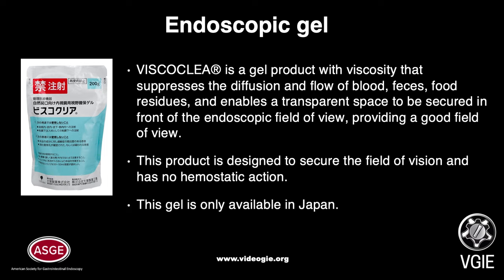Viscoclea is a gel product with viscosity that suppresses the diffusion and flow of blood, feces, and food residues, enabling a transparent space to be secured in front of the endoscopic field of view, providing a good field of view. This product is designed to secure the field of vision and has no hemostatic action. This gel is only available in Japan.